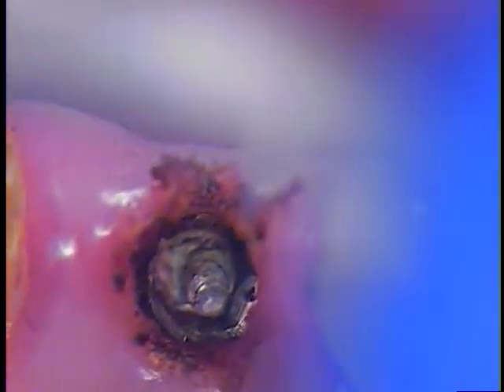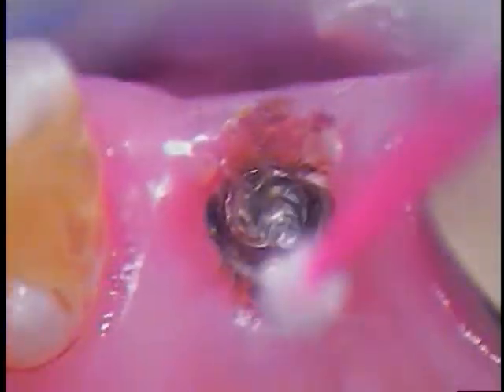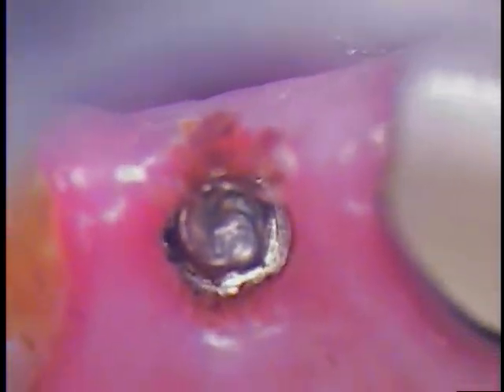I'm just going to make sure there are no tissue tags anywhere. So I'll take an explorer. I'm checking for tags. Now we'll ask for some rinsing. Go ahead. Coming around the distal.